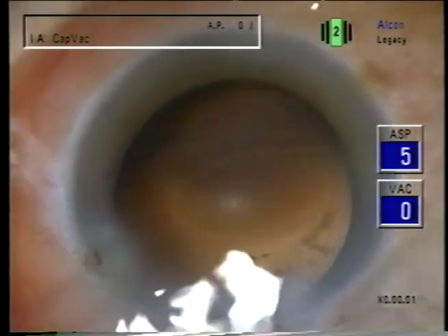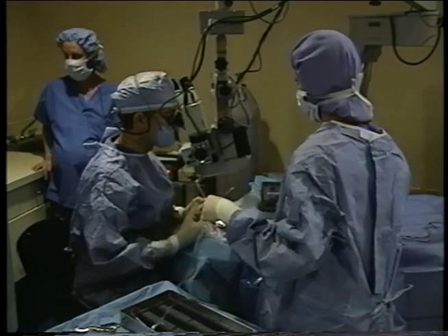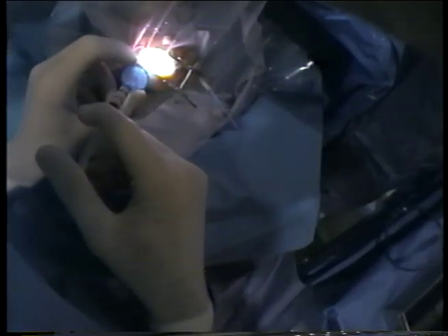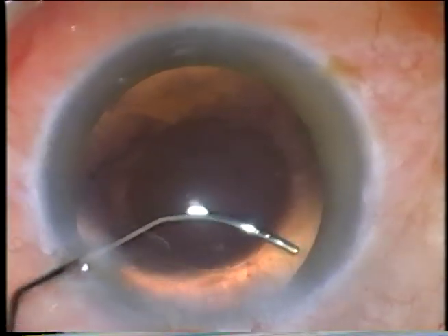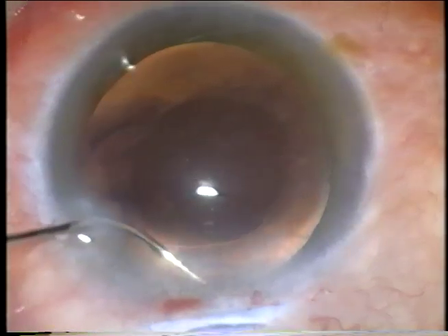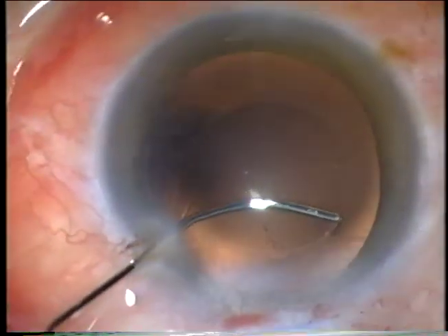I'll use the bent 30 to get this little bit of cortex from under the incision. So I deepen the chamber — self-sealing incision — it will deepen and then I can get the anterior leaflet of this little strand of cortex.